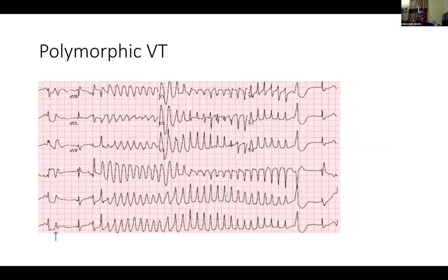This is a polymorphic ventricular tachycardia, reason being that you can see that... how many minutes remain? Is it up to 40 minutes, sir? Moderator, sir? 9 minutes, fine. I will finish so that we can discuss in detail.